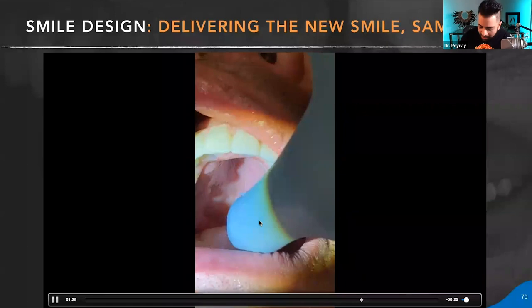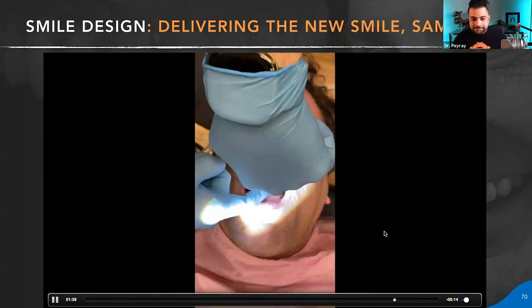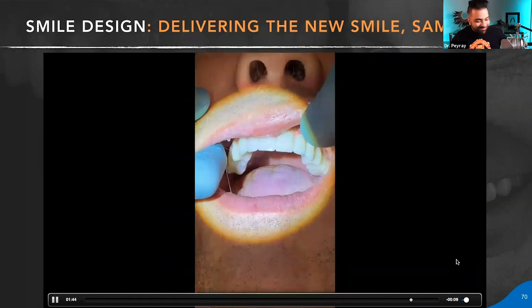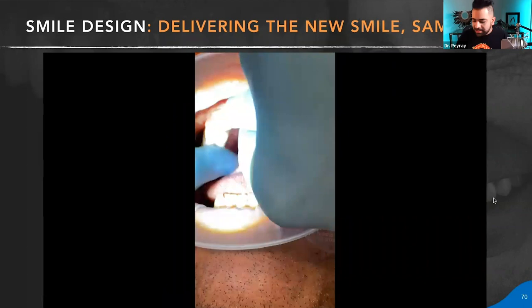Outstanding on the tissue, just enough pressure where it's going to train the tissue, right, Christine? It's very nice here. The bite we adjusted a little bit on this side, but not really. I'm going to bite down again. Perfect. Big. So again, now going next, you can see the smile design, the predictability.